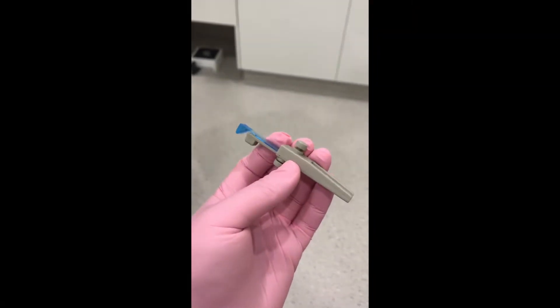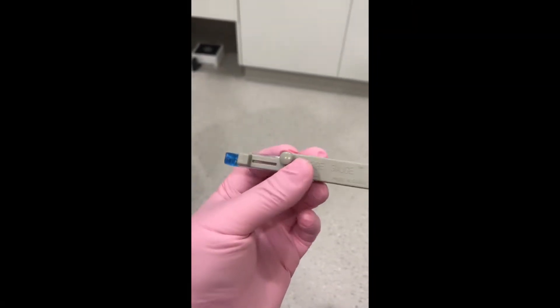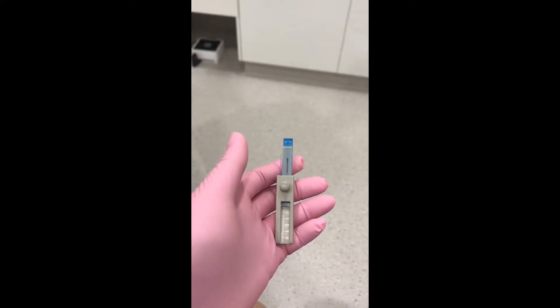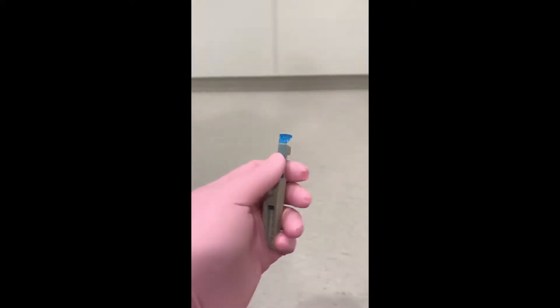To begin, try the George gauge in the patient's mouth without the bite fork. Adjust the lower incisor clamp to firmly grip the anterior mandibular teeth and tighten the lower turn screw to secure that position.